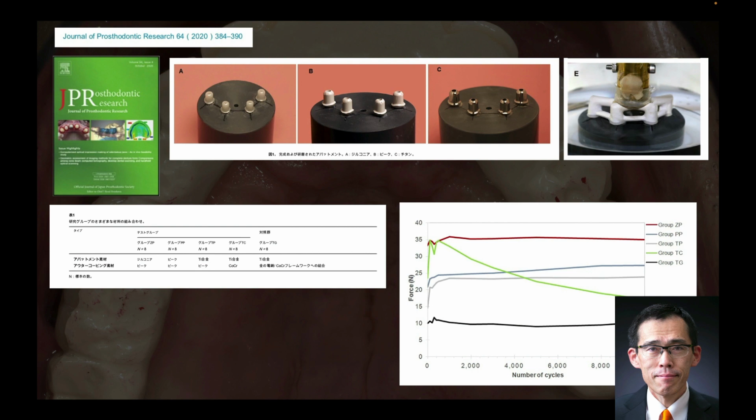In this paper, the combination of zirconia inner crown and PEEK outer crown shows high and consistent retention. This red line shows that over 10000 cycles, about 10 years of daily detachment, retention is stable. We decided this combination is the best combination for the patient removable prosthesis.